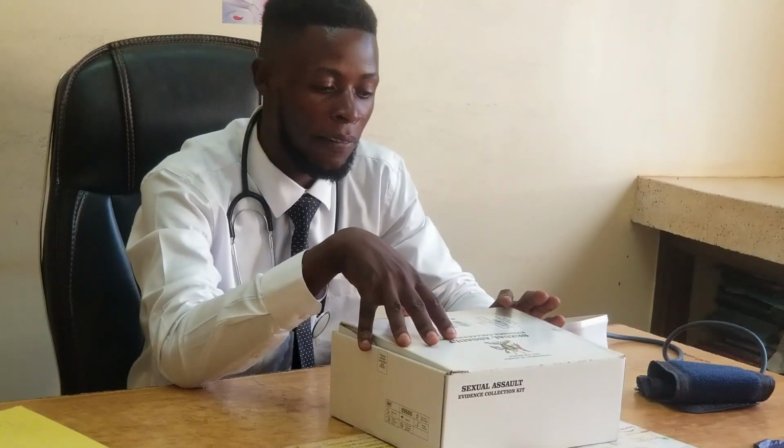It has over 13 different steps, or different things that you have to do for better evidence. But first, safety first, like we do in health: you have to protect yourself. Two, you have to have a clean room. Three, you need to have a screen, and then a clean Macintosh. Then you need to have a Cusco speculum with you, like we are going to see in the steps as we go on. When you open it, it has surgical gloves.